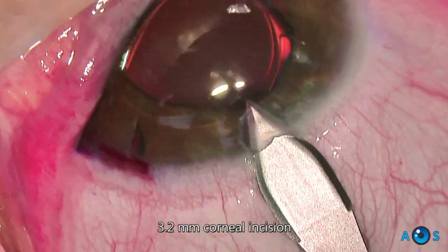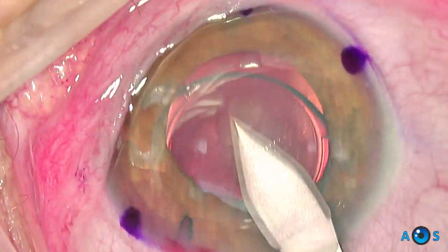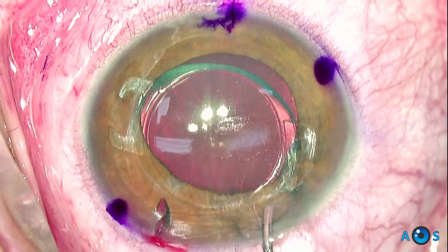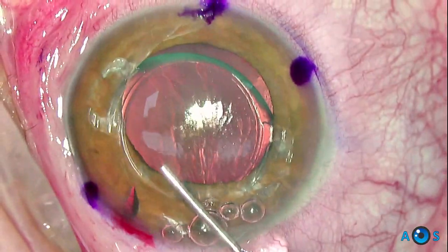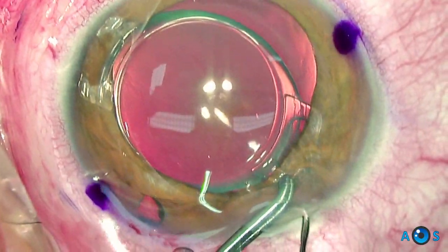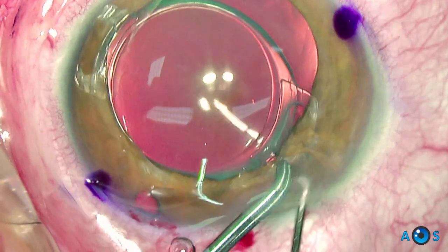As standard, two corneal side ports are created lateral to the main 3.2 mm corneal incision. Cohesive OVD is injected to fill the anterior chamber and protect the endothelium.